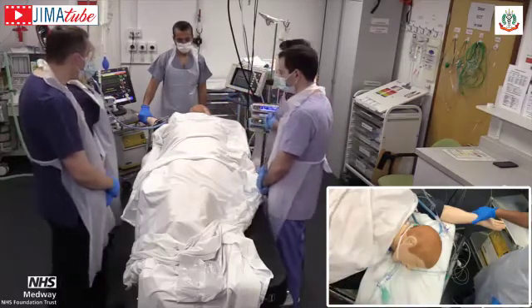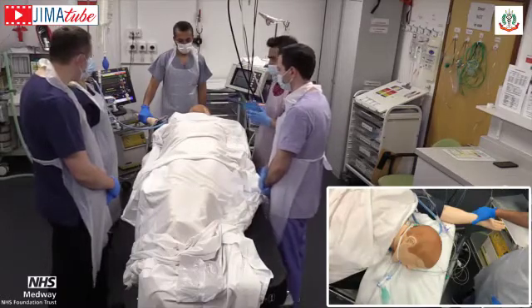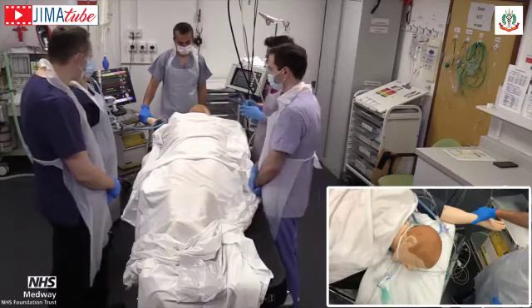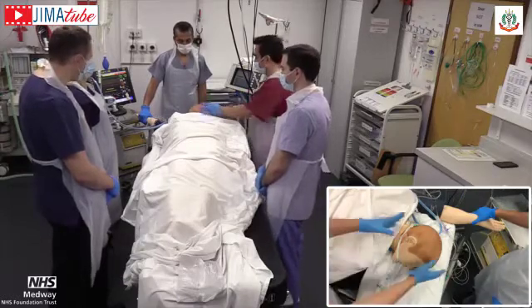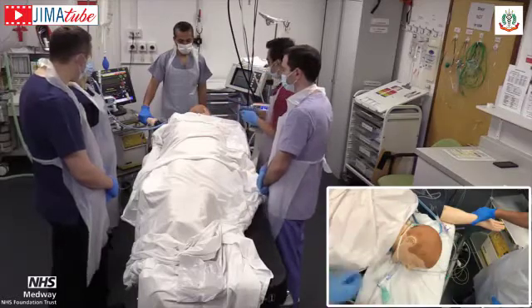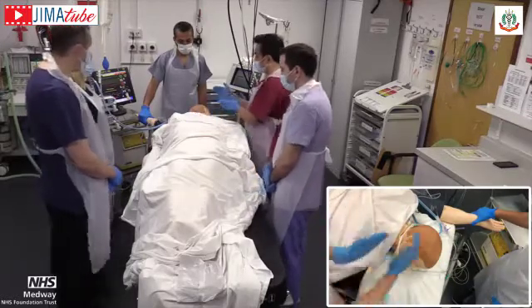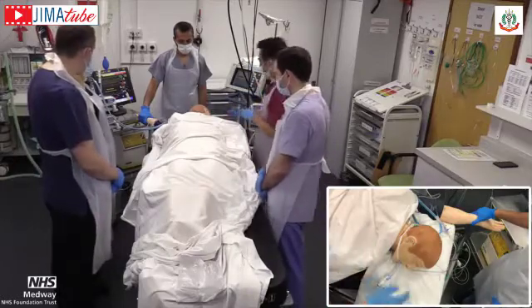Now, sometimes we do have a situation when the neck is very rigid and not flexible at all, and we just have to make sure that there is a strategy for that as well, in which case you can't keep the head like that. Then what we do is we move the patient slightly outside the mattress and keep the head in neutral position. So Vipul, do you want to show that, please?